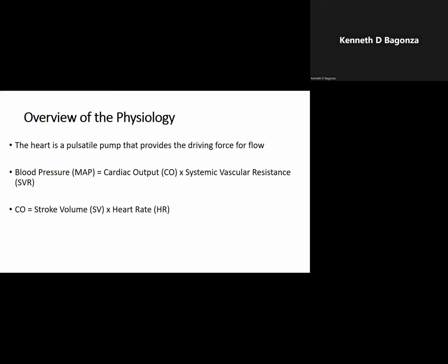The doc presented to you that there are narrow complex tachyarrhythmias, there are wide complex tachyarrhythmias, there are those which are regular, there are those which are irregular, and these have different energy selection modes. So you deliver the energy, and what you're looking for is that you need to see the patient reverting back to their baseline rhythm, and then you continue monitoring them.